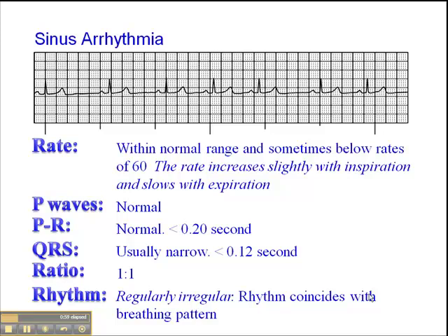What we see is a pattern where the heart rate is slow in one section where the patient is exhaling, and then you see a section here where it increases in speed on inspiration. And then it starts to slow again. So it's a repeated pattern where the heart rate varies with respiration.